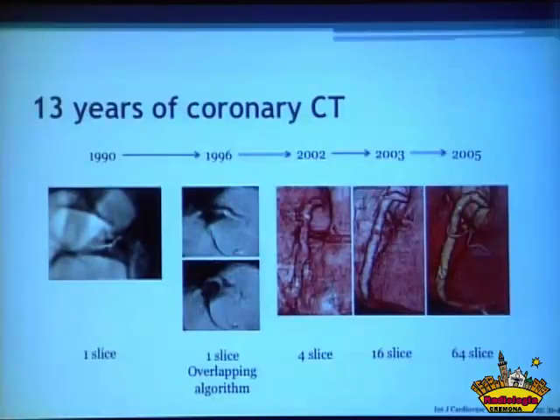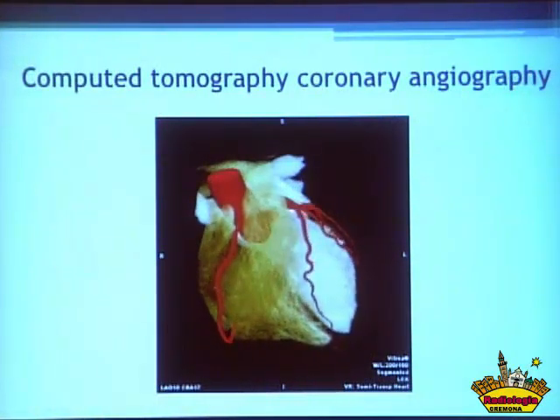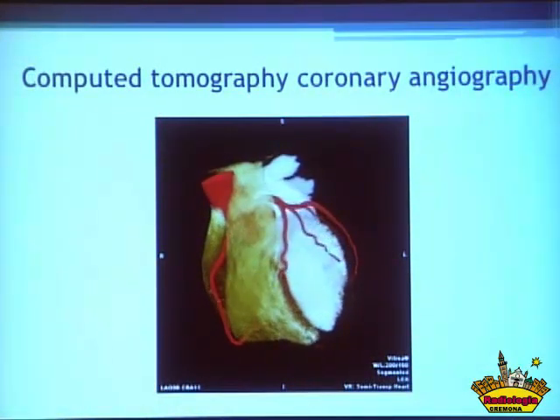Cardiac CT has been around for quite a while now. Back in the 90s, it was possible to see roughly where the heart was in the chest. You could see there were some coronary arteries, but you really couldn't make any diagnosis on what was going on inside them. However, as the scanners and our reconstruction techniques have advanced, it's become more and more possible to see the coronary arteries and see within them. This is an example of some normal coronary arteries on our scanner from Edinburgh.